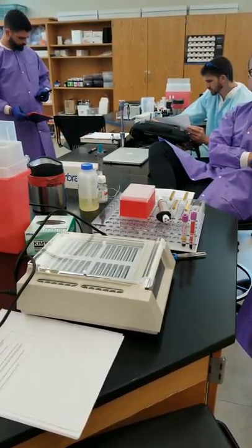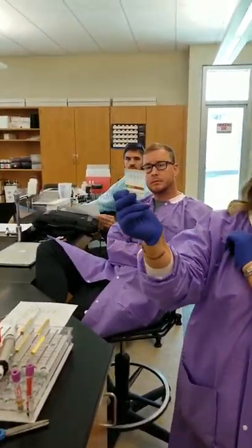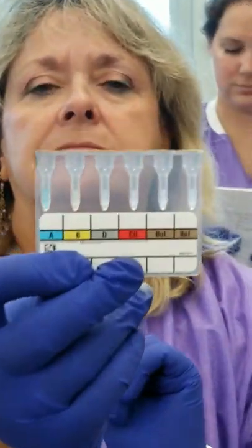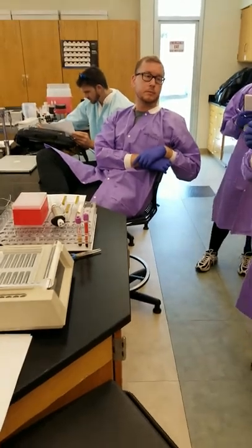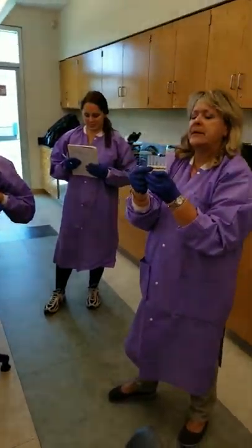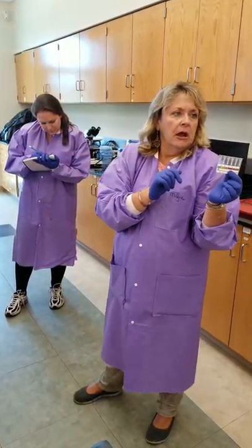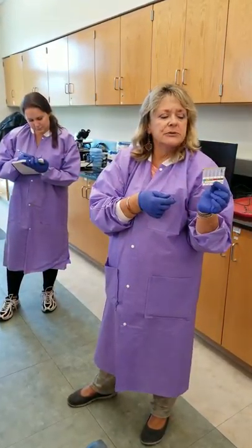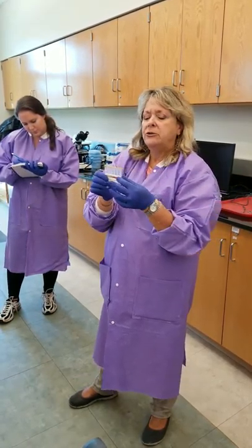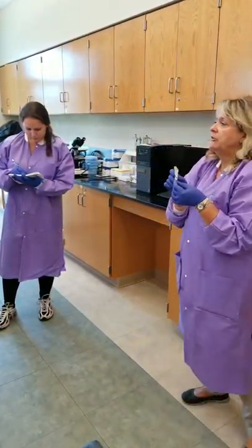The ABD cards look very familiar. You can see the blue and the yellow, like you can for everything else. That's A and B, over here and over here. Do I need to give you a black background, whatever? So you have anti-A in this first well, anti-B in the second well, anti-D in this third well. Then you have, as we were talking about earlier, just inert protein concentration, probably about a 6%. You run that as a control, and then you have 2 empty wells to use as your reverses. So this is what you would use if you were using this technology.